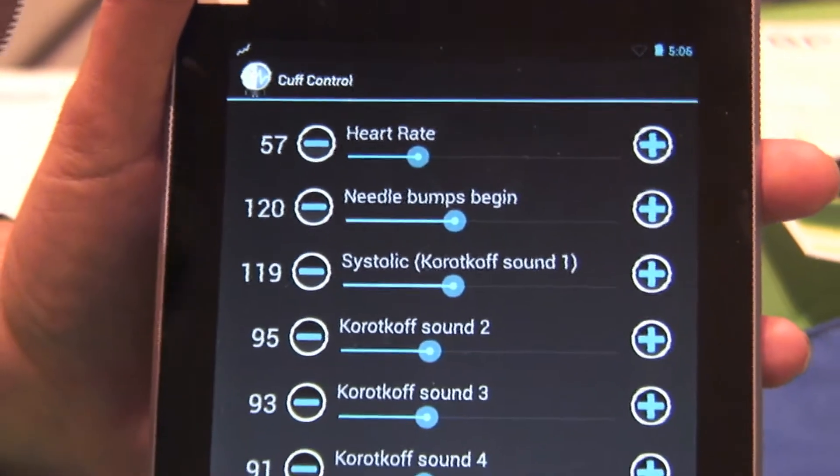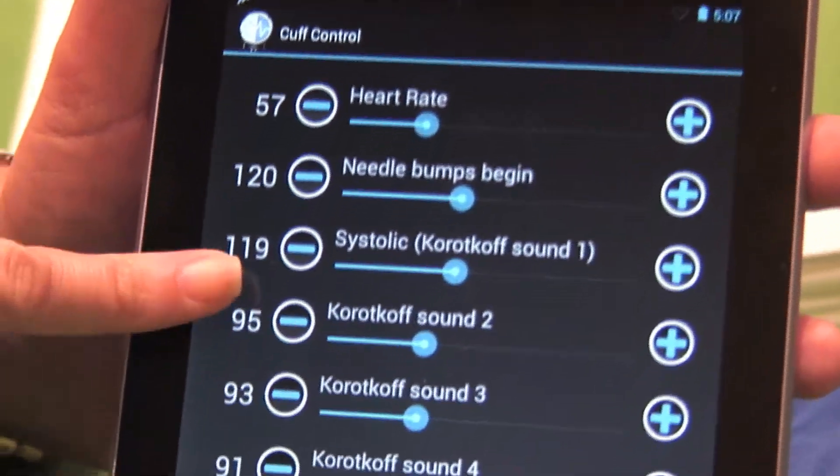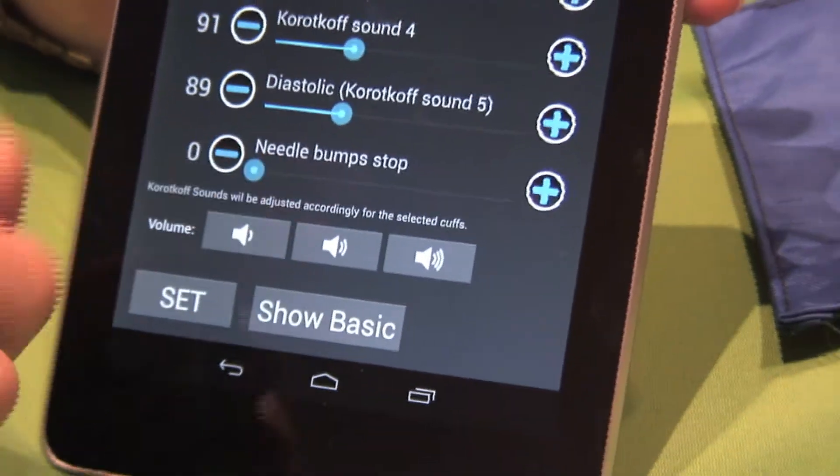On the mannequins, it doesn't happen that way — it's all simultaneous. We've been able to put the program together so that you can duplicate all the different sounds and when your final needle bump happens.